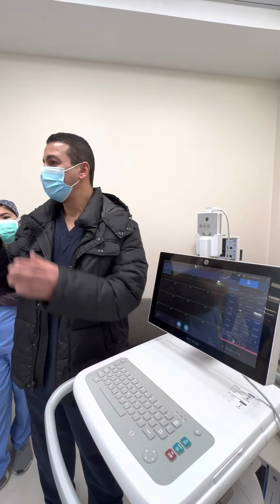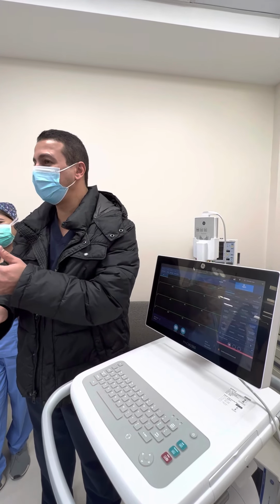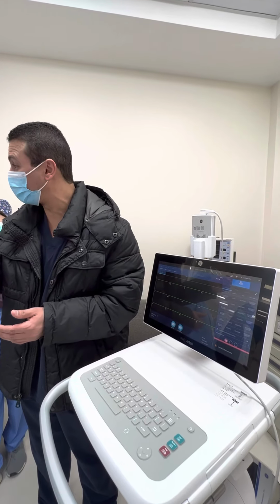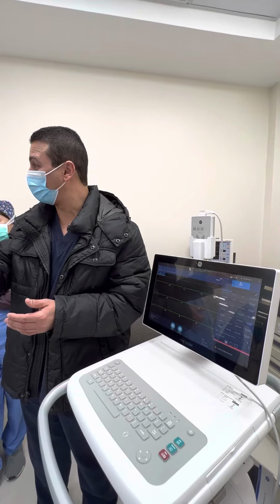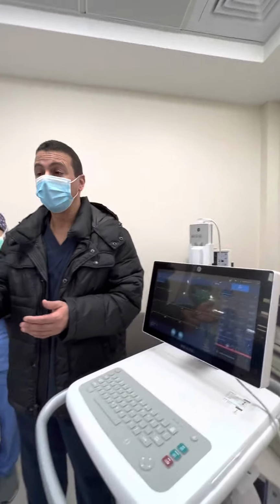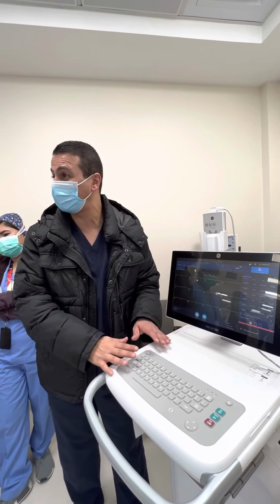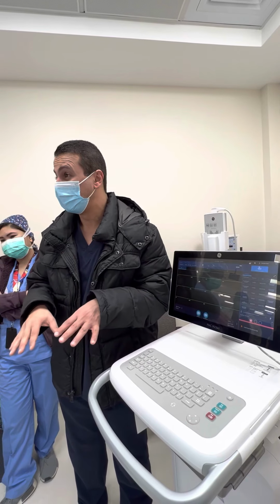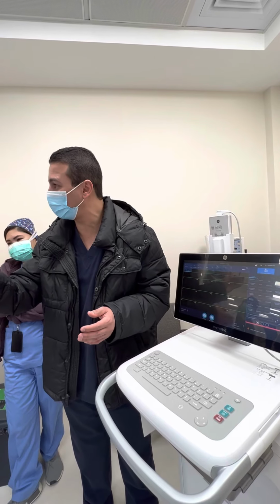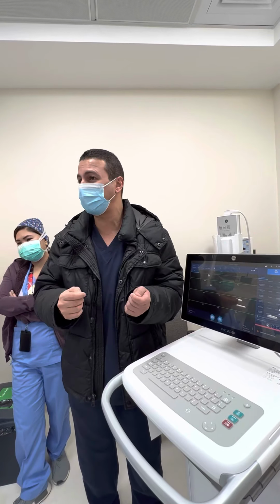Sometimes a lot of reports come from the ER department without patient IDs, or duplicates, and that will make them suffer in their department because they are Muse users. Before they confirm these reports to you, or show them to the physicians, if a second opinion is needed, they have to do the job. If they find a lot of rubbish coming in from ER, they will escalate from this side. You know that you have 50% or even more of the ECG reports of the hospital in the ER, so you have to make sure that you do the workflow in the right way.